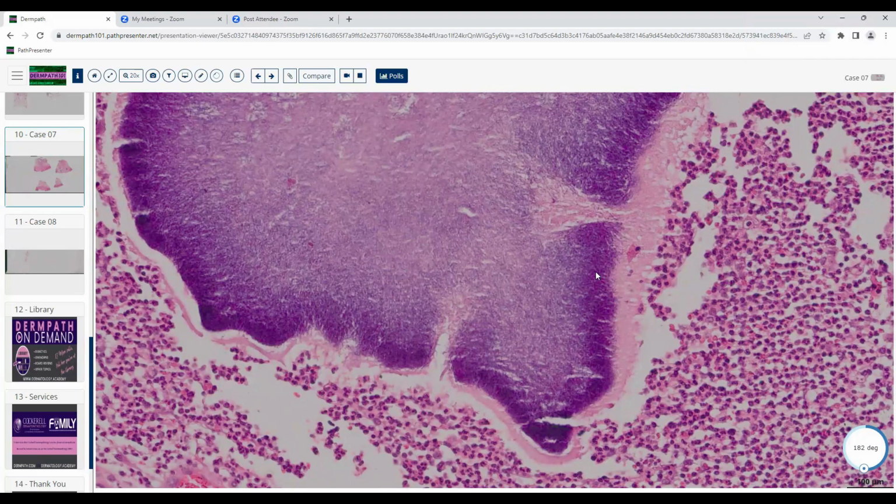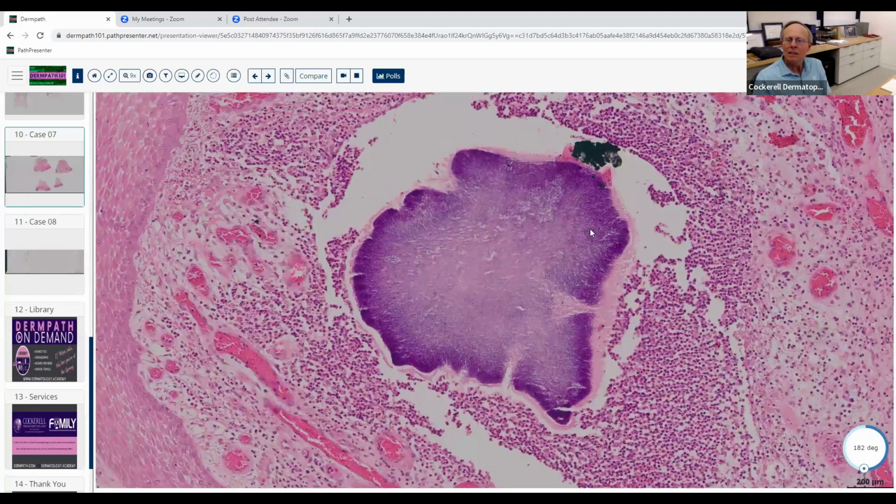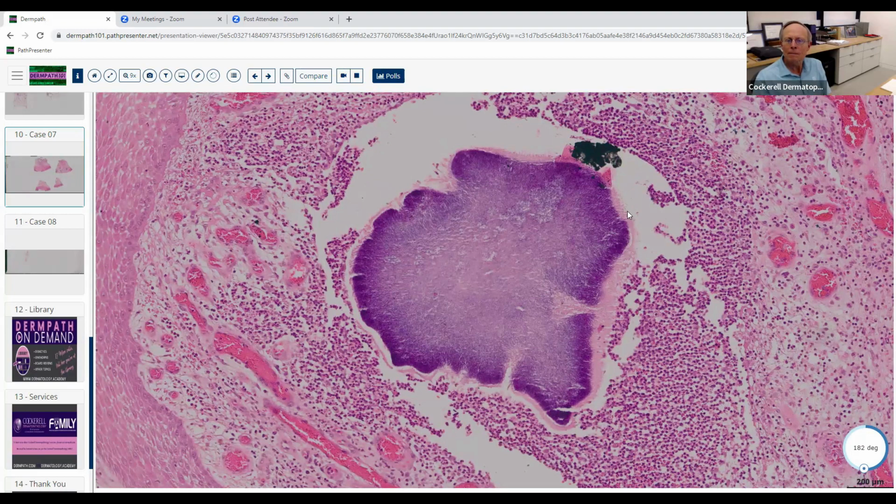Now, are these gram-positive cocci here? It's kind of hard to say. I mean, they don't really look like cocci, do they? No. Diffuse, maybe filamentous bacteria. It looks kind of diffuse, and we're not really sure what the morphology is here, but they may be forming little filaments. At the periphery, it's got this pink material that's a protein around this thing. Do you know what this structure is called? I do not.